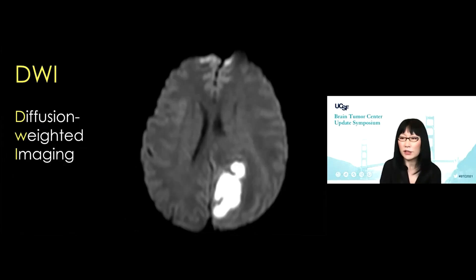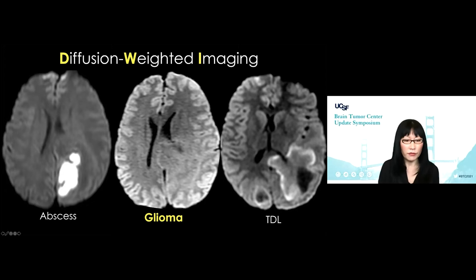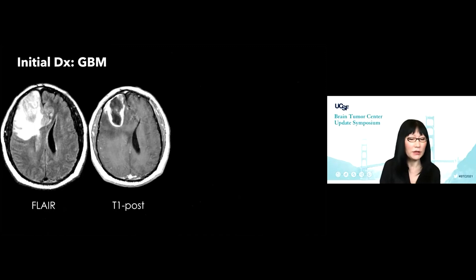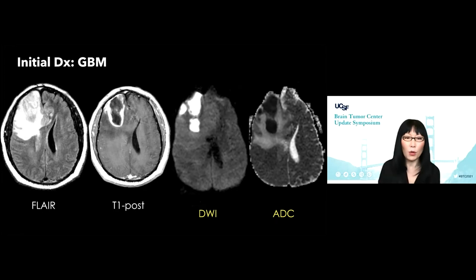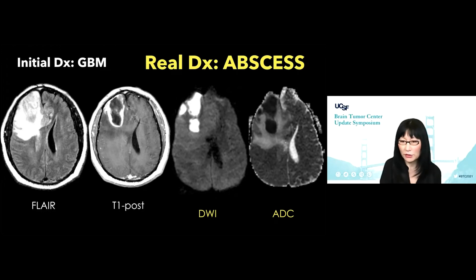Moving on to DWI — this is a critical sequence that tells us something no other sequence can. There are really three patterns of DWI we look for in patients presenting with a brain mass: homogeneously reduced diffusion, diffusion that disappears in the background, and lesions with a leading edge of reduced diffusion. Here's a gentleman referred to us with a stated diagnosis of right frontal glioblastoma. But once you add diffusion and ADC map, the whole rim-enhancing lesion is homogeneously reduced — this is hallmark, pathognomonic of an intracranial abscess.